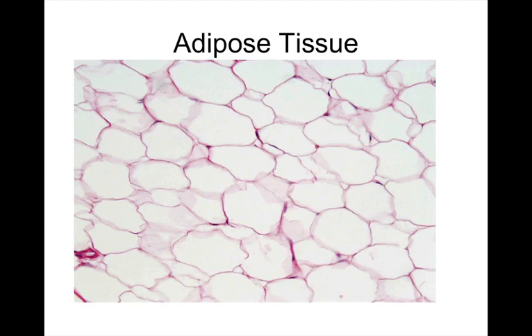The nuclei aren't super apparent in this one, but ordinarily they are, and you can see the outlines here, and these sort of overlap. It looks like the blade cut and smeared some stuff around. I think our stuff might be even a little bit better for a change. If you look at this cell, this is probably not a capillary. I think that's probably the nucleus smushed off to the side. This is probably a capillary over here.